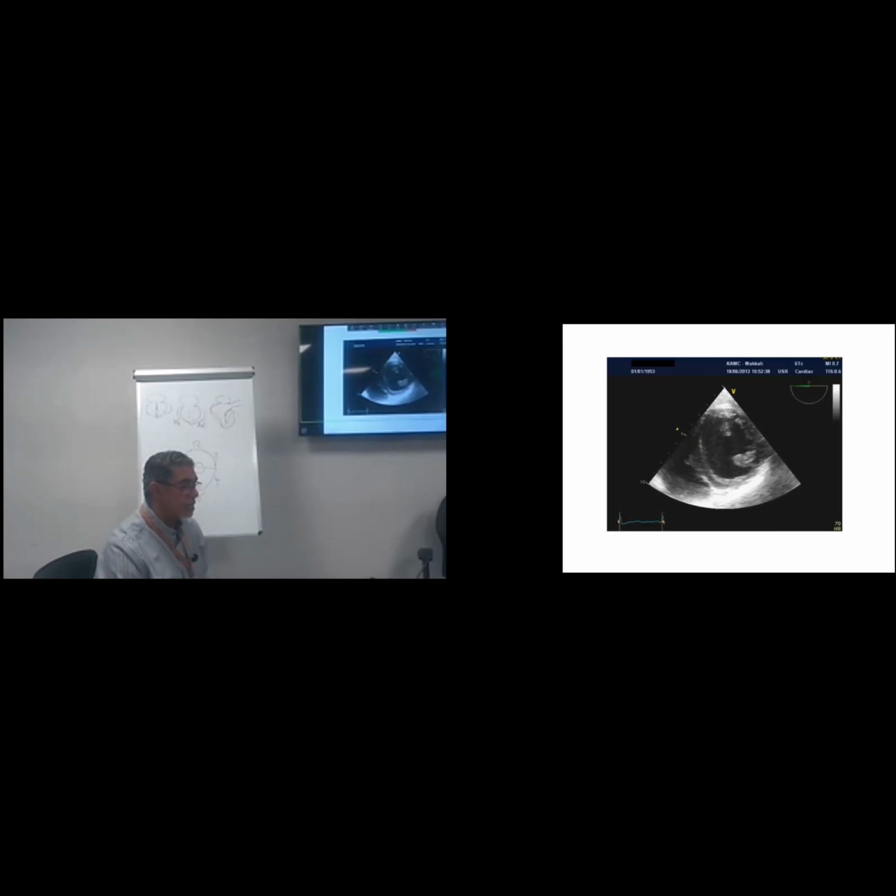Inferoseptal only? Let us review again. You remember the most important areas: 12, 2, 6, 8. Area 6 and 8? No, 6 and 8 are totally normal.